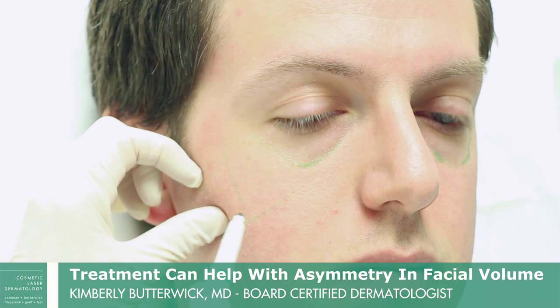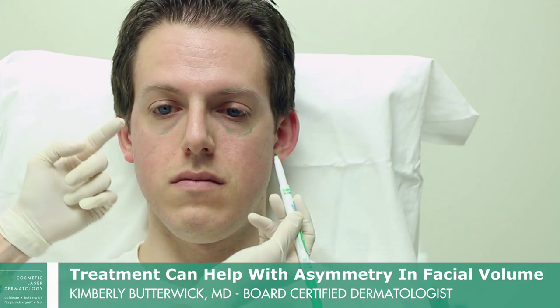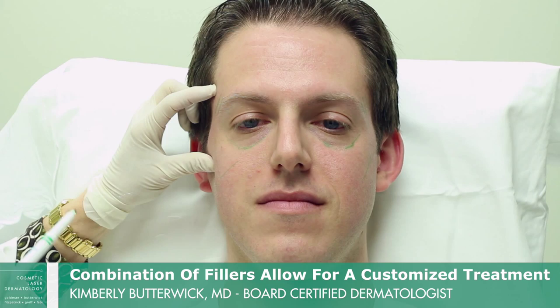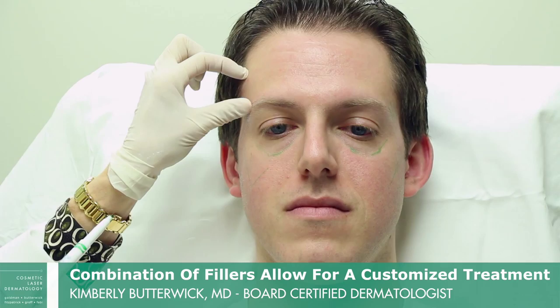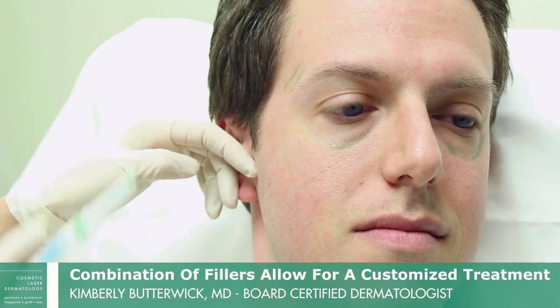This face is very flat, so we're going to add a little of the radius in both areas, but more on this side to lift the face and add a little more fullness. We all start to lose volume in our 30s, and men will lose it in the upper third of the face — the temples will cave in a little bit. So if we fill that up, it's a younger look.